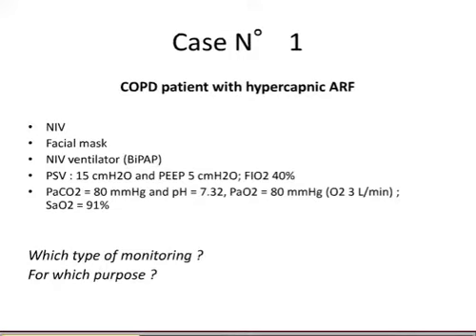I disagree, because it's not available. I don't have any machine. I have 42 beds. I don't see your point. It's a very simple system with an ear probe where you have both saturation control. There are many simple systems, but they are still costly, and you have to have them. Simply spoken, it doesn't mean that you need to apply this kind of monitoring to all patients, but just to those who are on non-invasive ventilation.